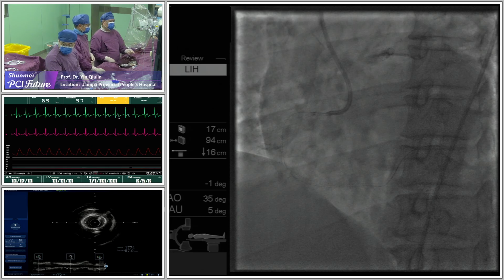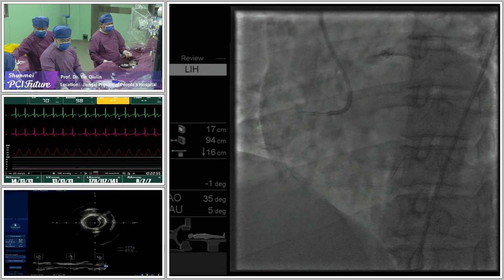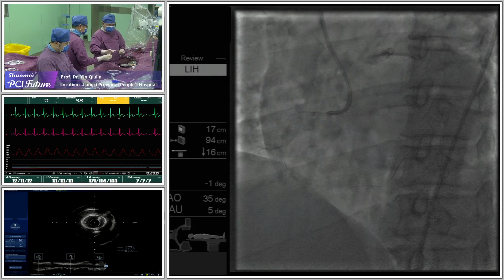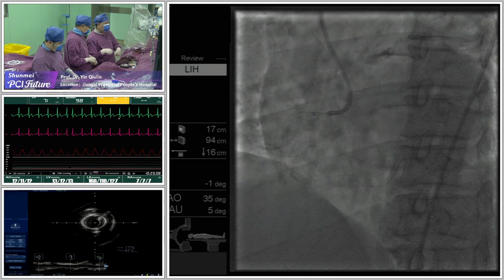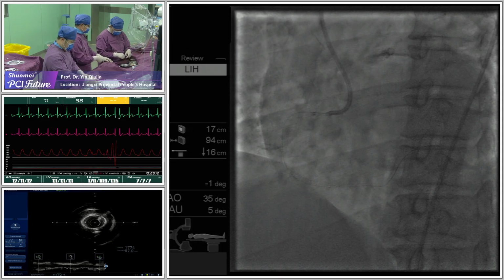So, do you think that the local effect is equal to the reverse CART? I think maybe the proximal segment, the knuckle wire is in the plaque, but maybe beneath the entry point, it goes to the subintimal space.